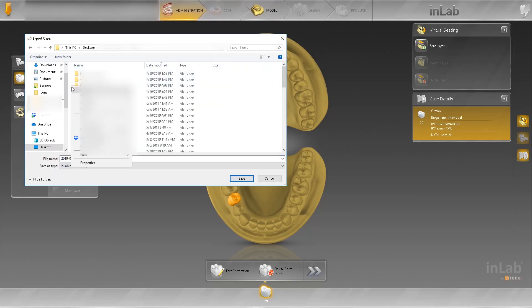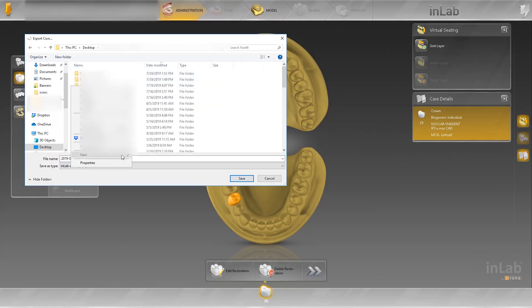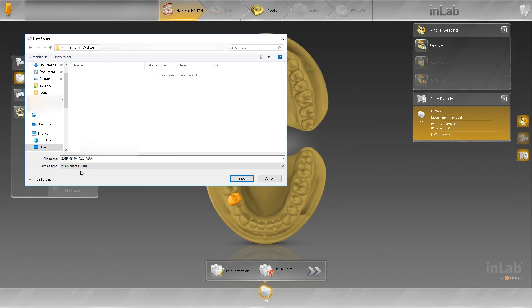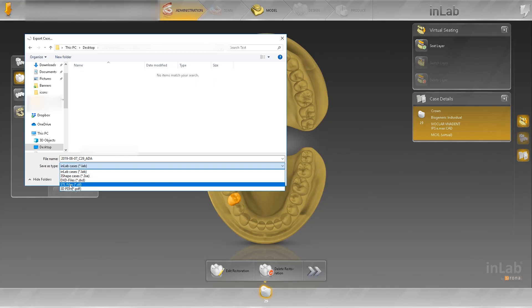You don't need to do anything. Just click on this down arrow right here, click on export, find wherever you want to download and store your file. We'll just call it test. Then go into the folder. You don't need to change the name here but you need to change the save as type to STL. Save.